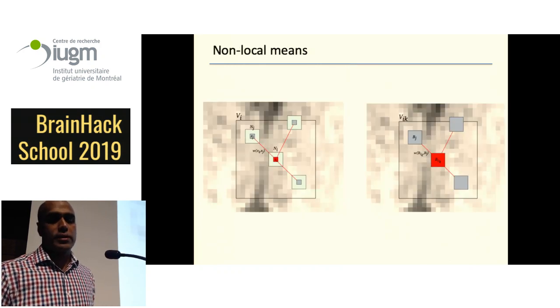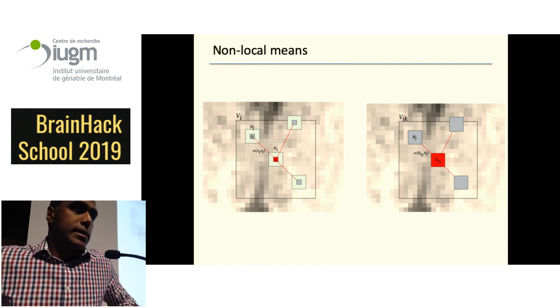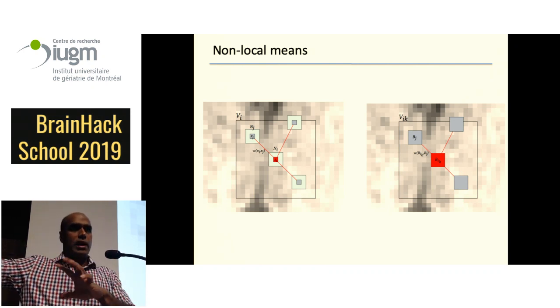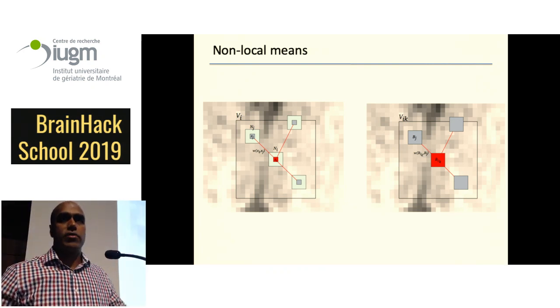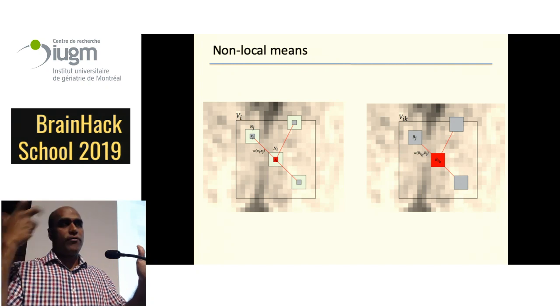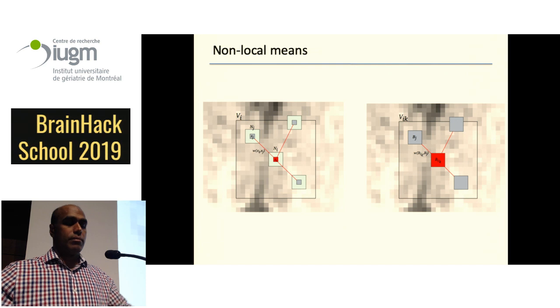And the way it works is kind of similar to the previous BEAST estimation, where it looks at a template library of images, and then it looks for voxels that might be most like it and creates a weighted average and tries to find the noise characteristic across the voxels and remove them. So that's basically it for Bpipe.